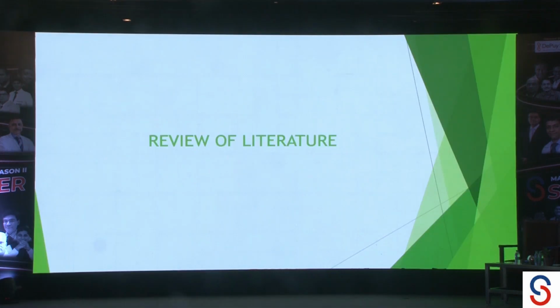That's the thing. So now I would like to learn one more thing. A question, sir. I have a case that dislocated in 4 days' time. How could you increase your offset so much in 4 days? That means on day one, were you not perfect with your soft tissue tensioning? Otherwise, how can you increase that gap so much? That is one thing, yeah.